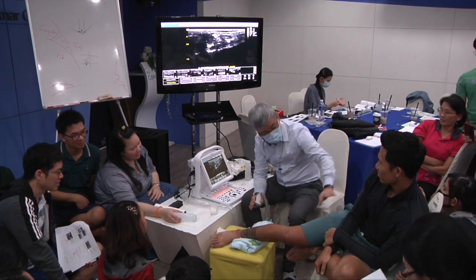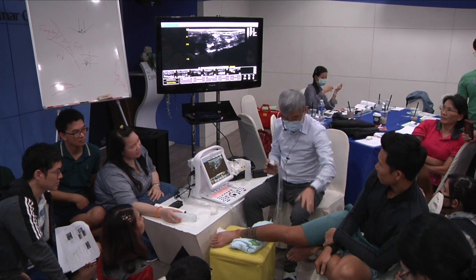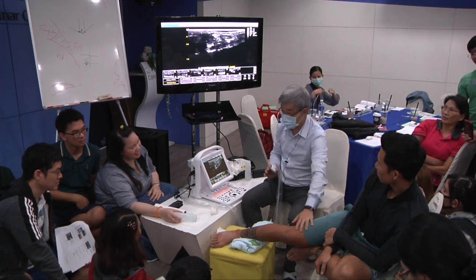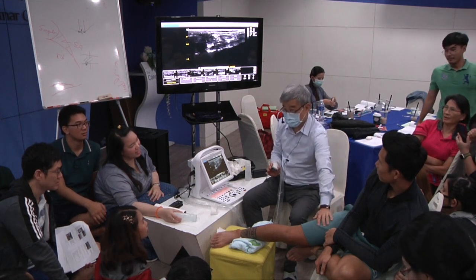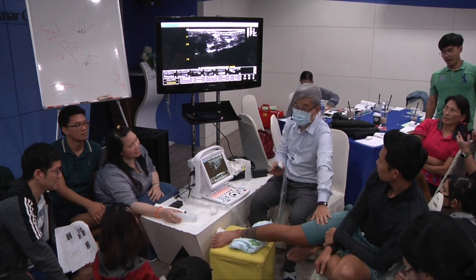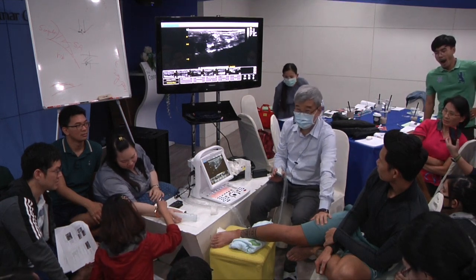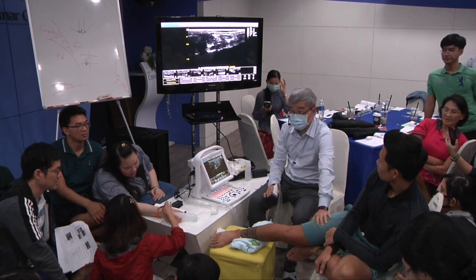Okay, the same position, basically side lying. That's why we modified the procedure, and then we informed our teacher. We probably use the same idea, but slightly different to what you suggested 20 years ago. We changed the position from long sitting to side lying.